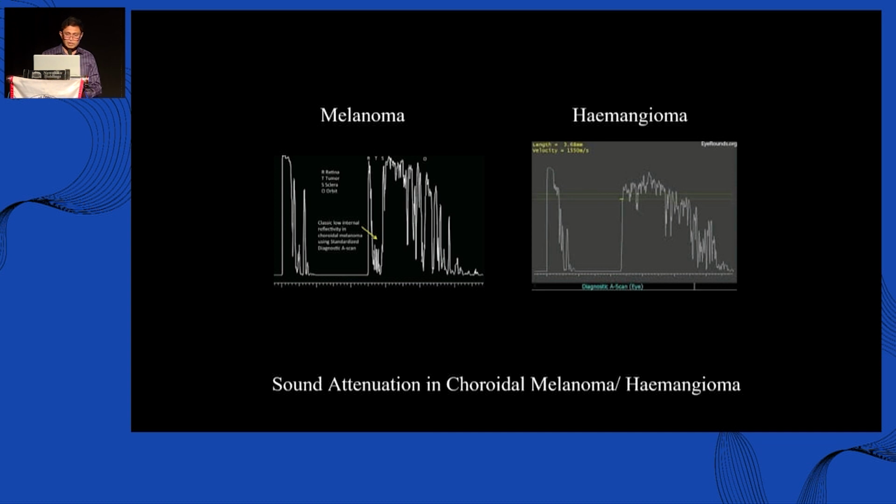If you can see this one classic thing, melanoma and hemangioma usually is very much helped by the A scan. There was one case when I was a registrar where an eye with a hemangioma was removed because it looked so typical of a melanoma. We counseled the patient and did the enucleation, the proper procedure, and then we did the biopsy and it came back as a hemangioma.